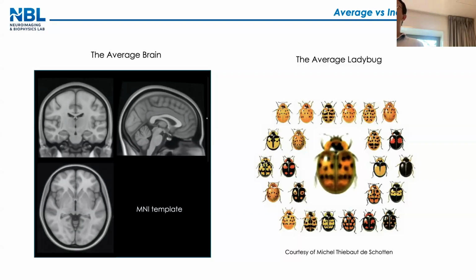And I think maybe Steffi will talk a lot about this, so I'll just stop here and not go further. But I just wanted to say that this is one of the benefits of tractography. Tractography is born to live in native space. Although we can do something in MNI to normalize, to have a template atlas is fine, but we have to be careful not to lose anatomical variability from our data, okay?